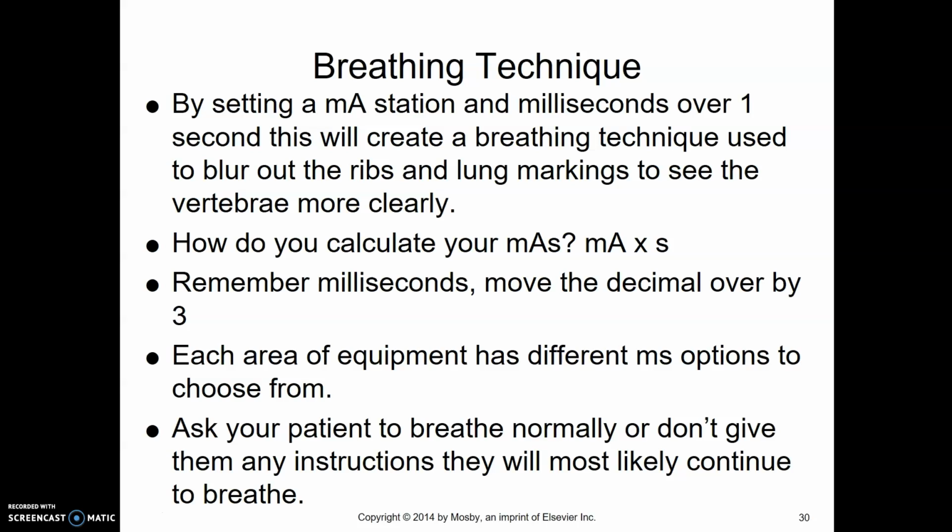If I have 20 mA in 1,000 milliseconds, you're just doing 20 times 1, and that's super easy peasy lemon squeezy. And then Main Street, I think we can get up to 3,200 milliseconds. And then miscellaneous, I don't think we can set our milliseconds really much at all. It really doesn't go over, I think it's 2 seconds, and it's really super finicky. So it's going to depend on the equipment and your ability, and you're just going to have to go through it in the area that you're in.